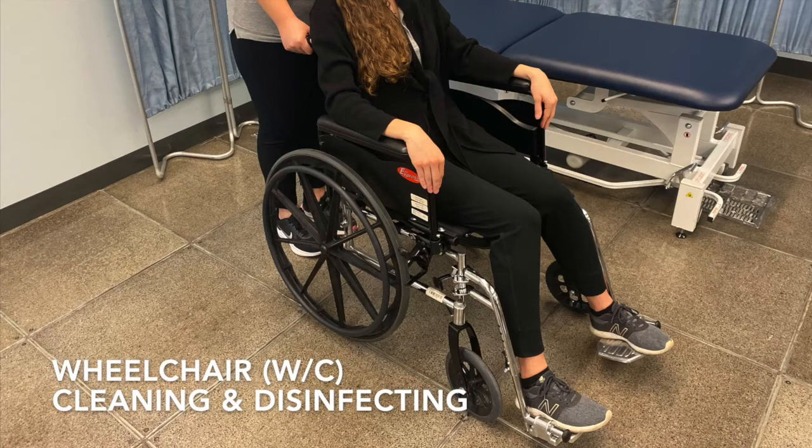This video will discuss the importance of disinfection and how to properly disinfect a wheelchair. It is important to disinfect the wheelchair after each use to prevent the spread of infection between clients and healthcare providers.